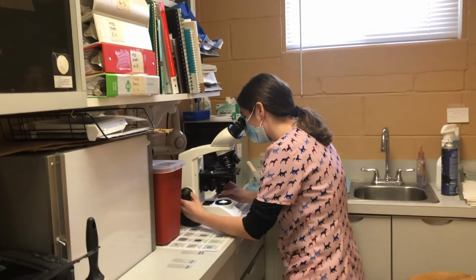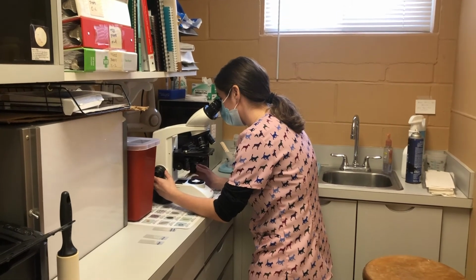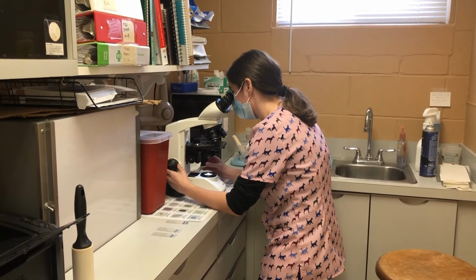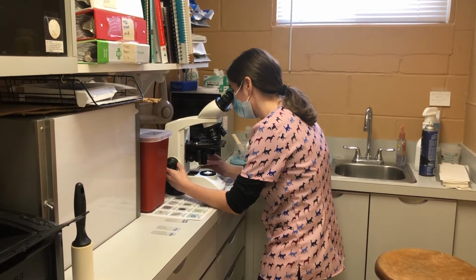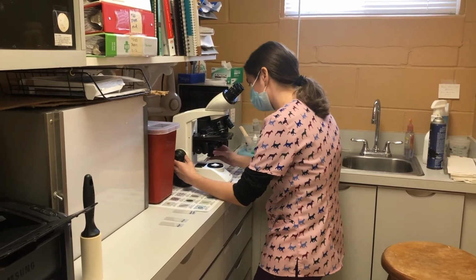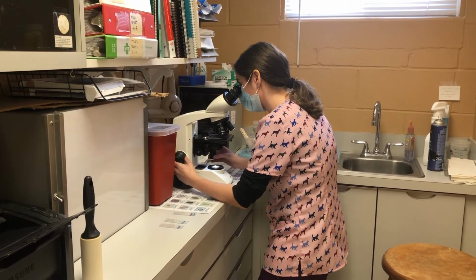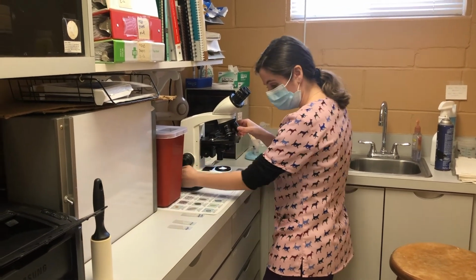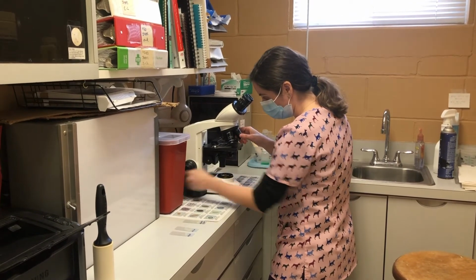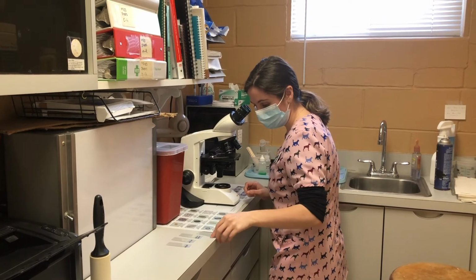And so right off the bat I can see that there doesn't appear to be any agglutination present here, but I'll look at the slide just to make sure. Okay, so that was our donor control, so I'll go ahead and switch to our recipient control.